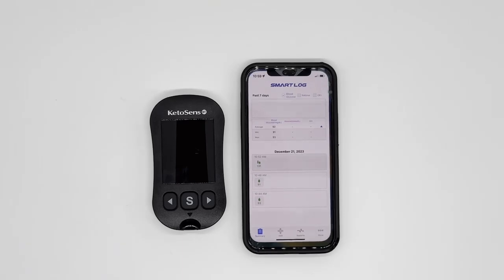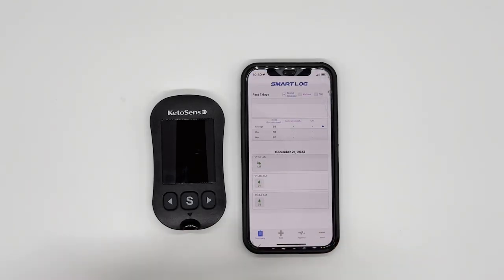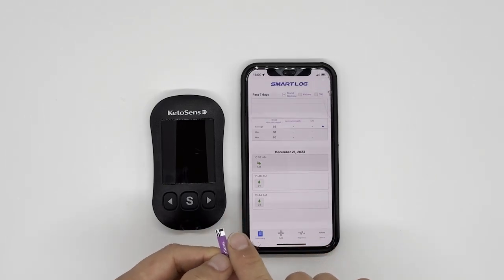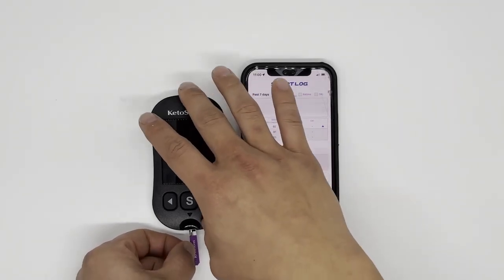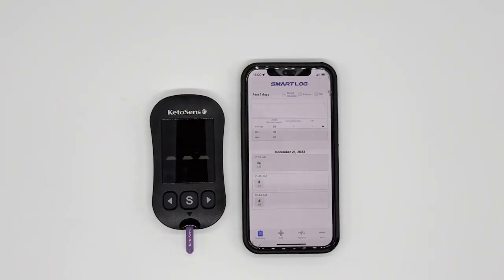You need a KetoSense test strip. Make sure you insert this part of the test strip into the meter — not the other way around. The pointy part is facing you, and the barcode-looking part goes into the meter. After three seconds, you will see a screen with a symbol meaning it's ready to receive a blood sample.